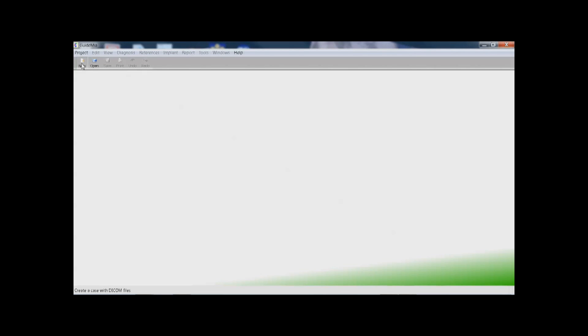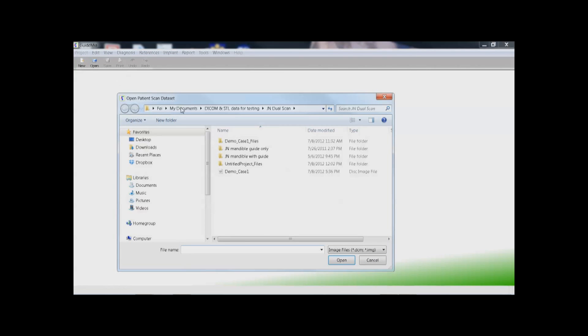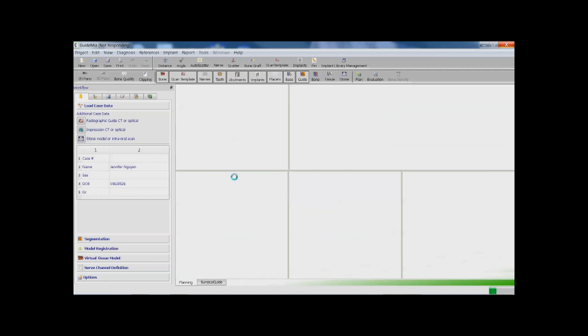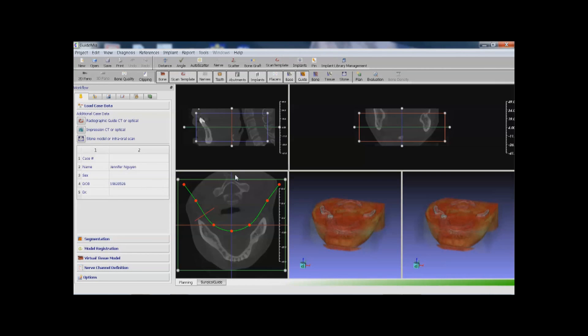In order to start a case, all we need to do is browse to the DICOM file folder and select any file in the DICOM series. The patient scan is now loaded.